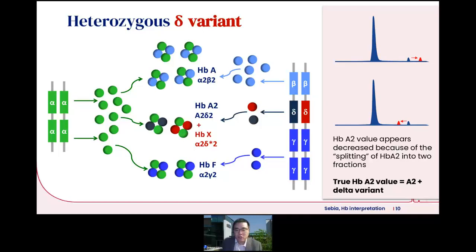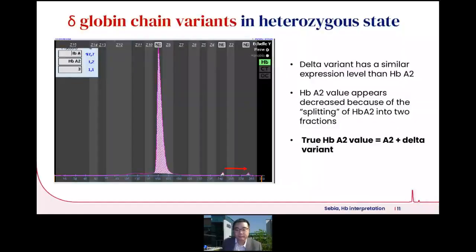Of course, the mutation happening to hemoglobin A2 itself would not be so much of a concern because it would not produce too much of a clinical impact. But the quantity of hemoglobin A2 would be the concern for a diagnosis of conditions like thalassemia. So once again, the true hemoglobin A2 value is a combination of the normal hemoglobin A2 and also that of the variant. So in this instance, you'll be looking at a true hemoglobin A2 value of 2.3%.